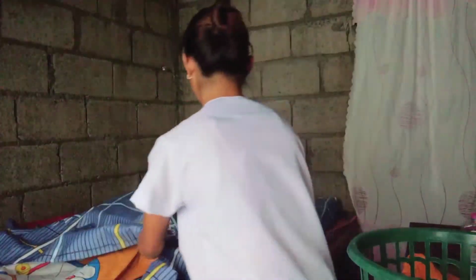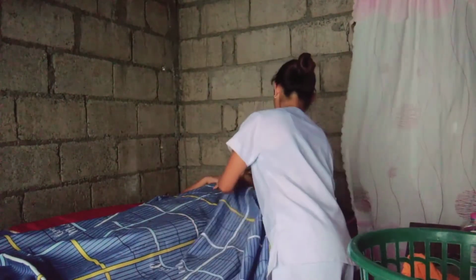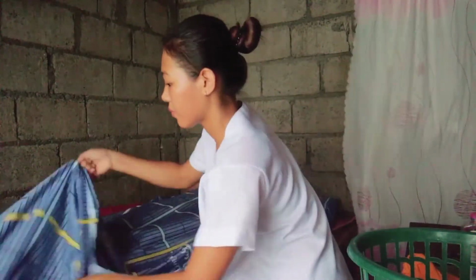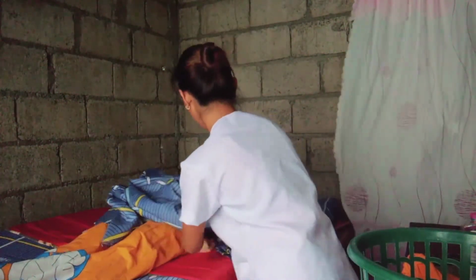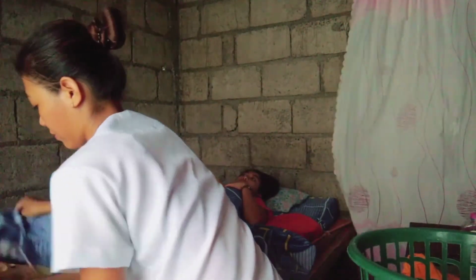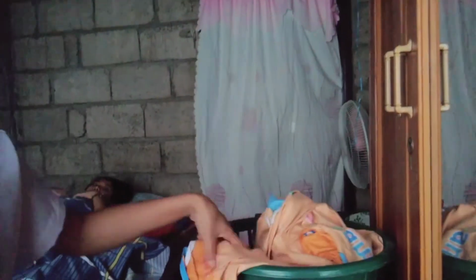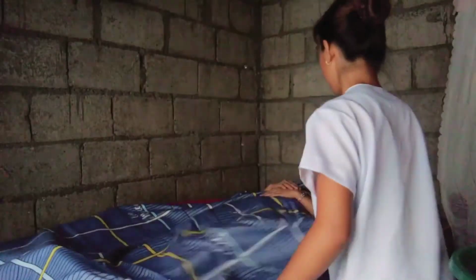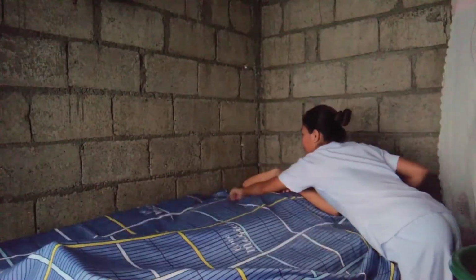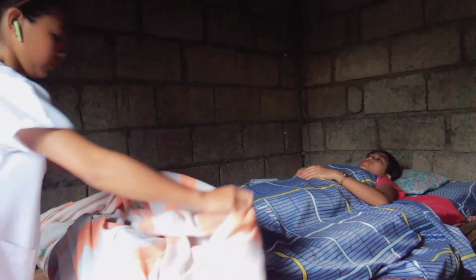With the patient holding the top sheet, remove the bath blanket and discard it in the hamper. Place the blanket on the bed and unfold it.